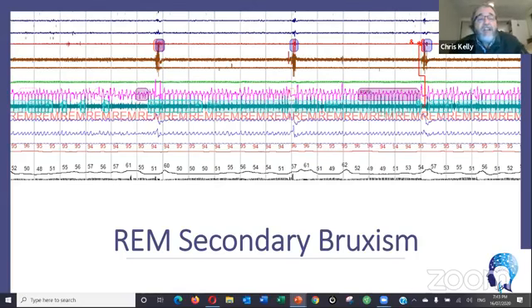Again, you see the pink line, which is the breathing line, and that's the RERA on the pink line, just to the left of where you were going. And there's another one, a longer one. Now you see those two to three big breaths happening. Any one of those you want to see, actually, off to the left around the 55, 51, 60, and then you go straight ahead up on top.